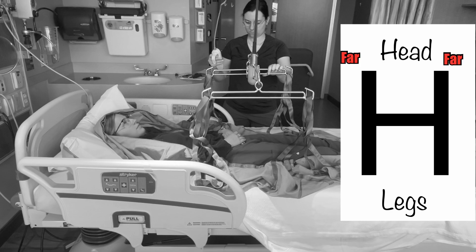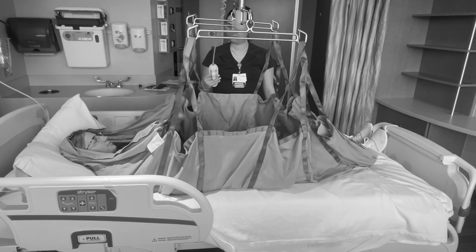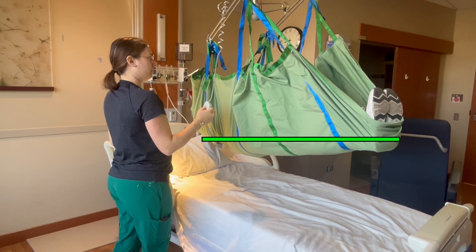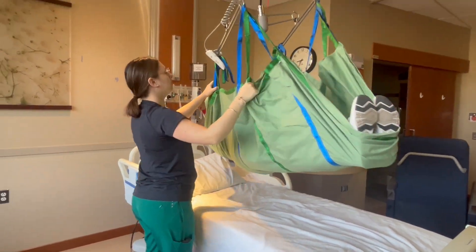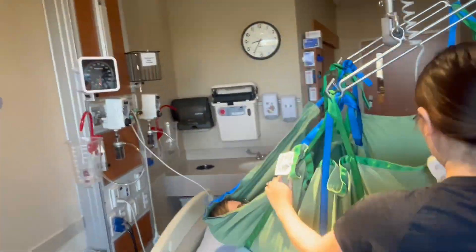In one example, all 16 straps were attached at their furthest loop. When the patient was lifted, the legs rose higher while the head stayed low. While this worked for transferring, the patient reported feeling that she was about to tip head-first out of the sling. To improve comfort, the eight head straps were moved to the closest loop and all eight foot straps kept at the furthest loop. When lifted again, the patient was noticeably more balanced and reported feeling much more comfortable. Once all straps are connected, push up on the controls to lift the patient until you can freely move them along the track. This sling can be used to transfer to a stretcher, fully recline a chair for transfer, or simply reposition or boost the patient in bed.